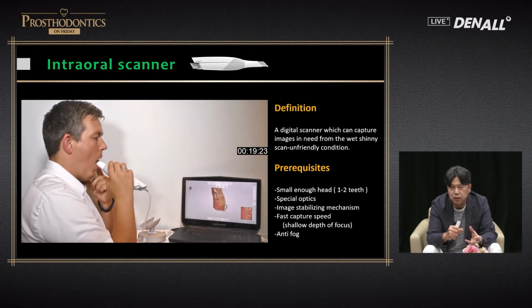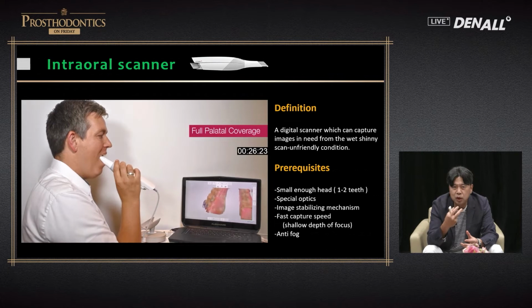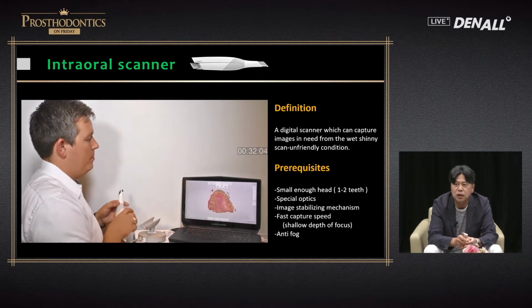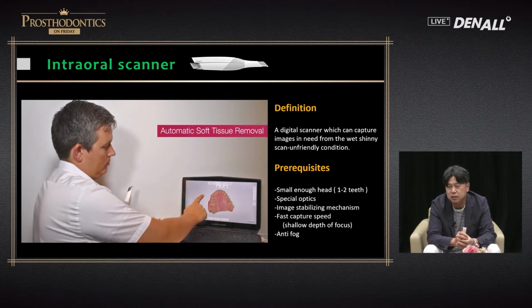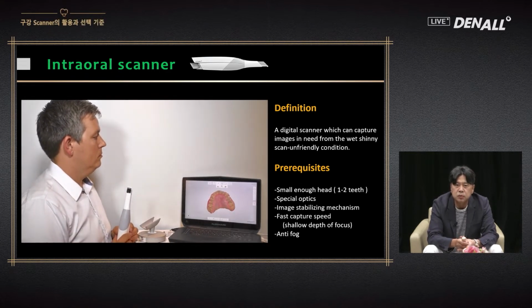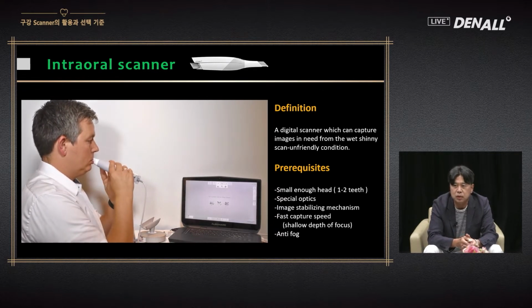So image stabilization technology, and the shiny teeth and the wet environment in the mouth should be overcome in the filming. Therefore, a lot of technologies are embedded in the intraoral scanner. In the past, we didn't have much variety. Up to 5 years ago, four or five products were available throughout the world, but now it is a commodity. So many companies manufacture intraoral scanners.